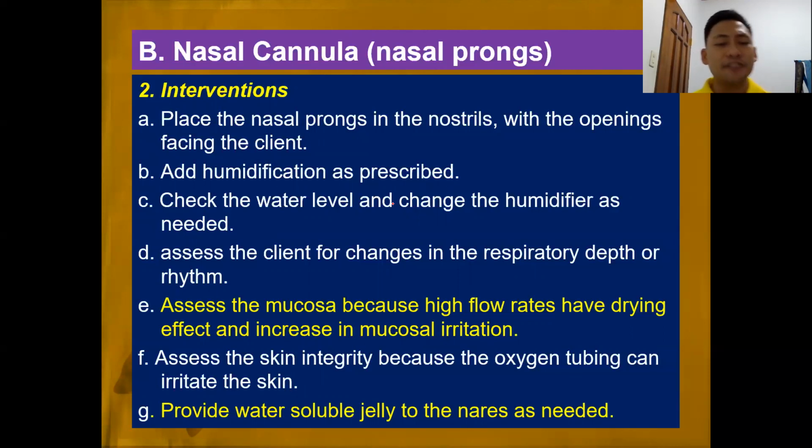We add humidification as prescribed. Depending on the rate of flow, you are regulating the oxygen unit. Check the water level and change the humidifier as needed. You can use sterile water in the humidifier. But of course, there are pre-filled humidifiers that can be purchased in the pharmacy.